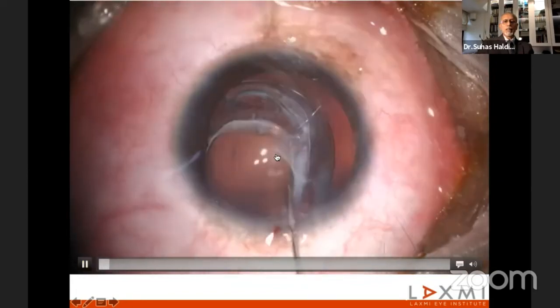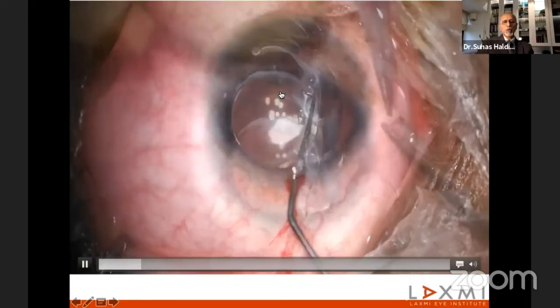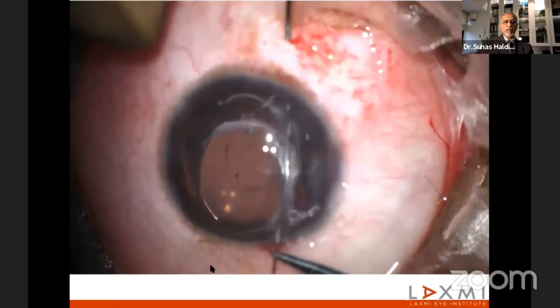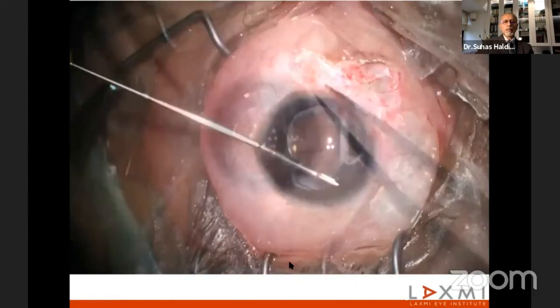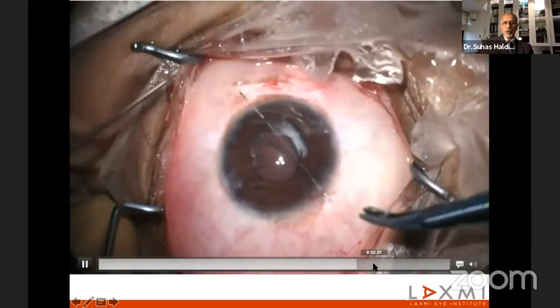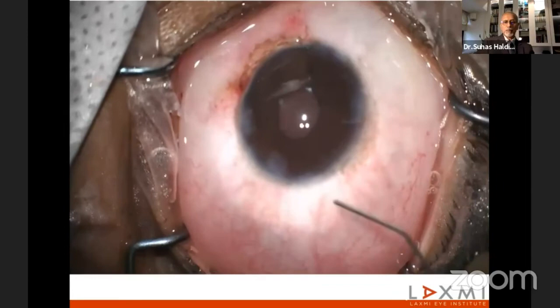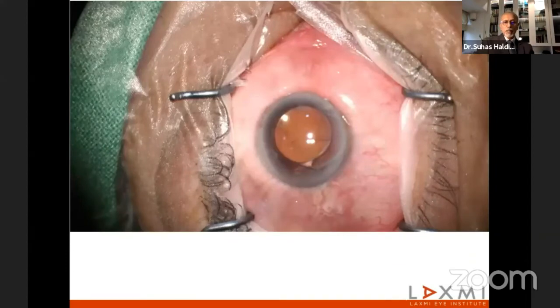And what has happened is the suture that was a 10-0 suture at that time, it broke and the lens came on this side. So this time, as it's a loose bag, I decided to go with the 9-0 needle and thread it through that central eyelet and try and pull it. And this time I didn't want to miss the chance and did a proper pupilloplasty and got a pupil centered. And with this, although he had trauma and his vision had never improved, over the years his vision continued to improve.